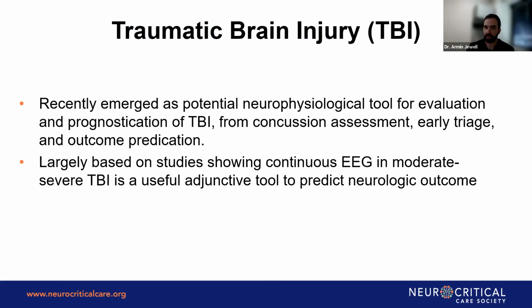So the TBI part of it is a little bit newer on the end of point of care EEG, so more information and data needs to be obtained regarding this. But in general, TBI has had some studies showing that continuous EEG does have a useful prognostic importance as an adjunctive tool in moderate to severe TBI.